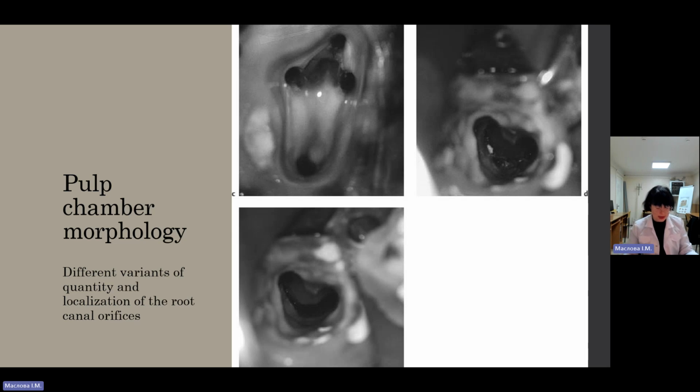Adequate straight line access reduces the angle of the curvature in the coronal thirds of the root canal, where it exits from the floor of the pulp chamber, and thus reduces the overall canal curvature. Further advantages will be discussed later.